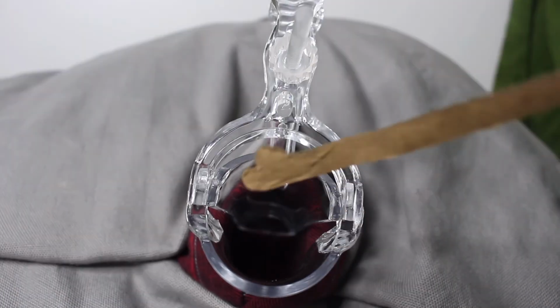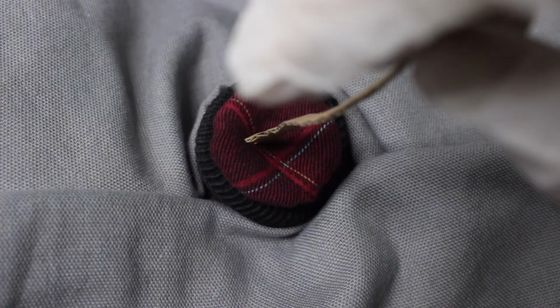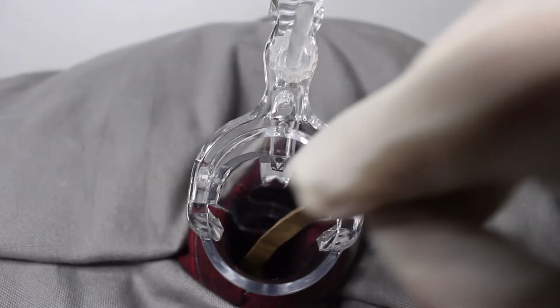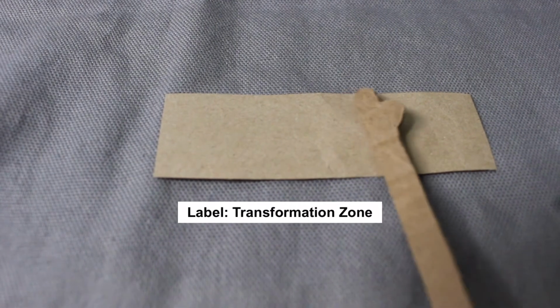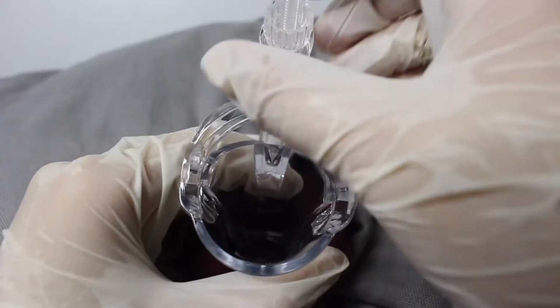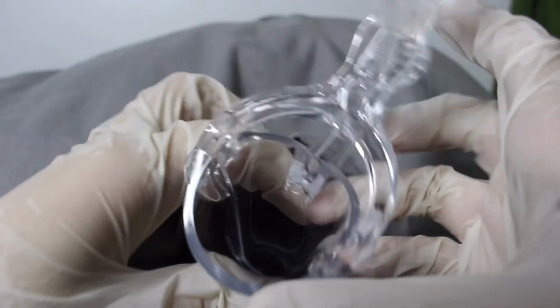With the Ayre spatula or some variation thereof, the entire transformation zone is scraped and the sample is smeared thinly on a second slide, which is immediately fixed and labeled transformation zone. Unlock the speculum and gently close it. Remove the speculum in the reverse sequence.